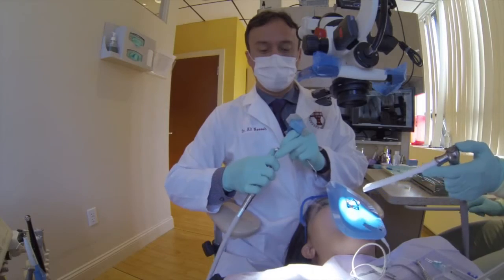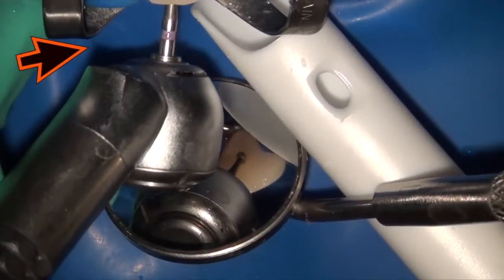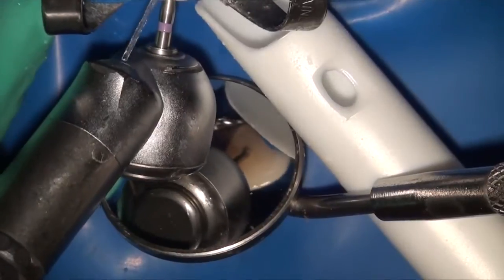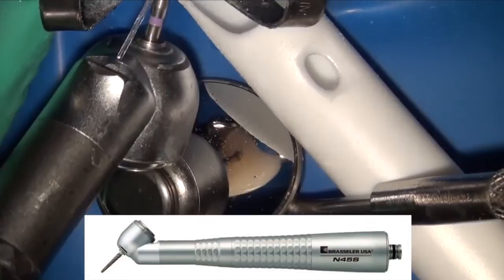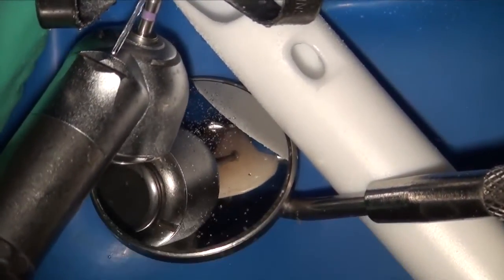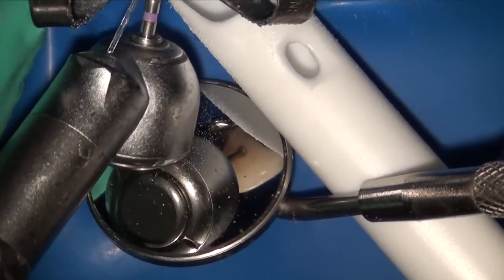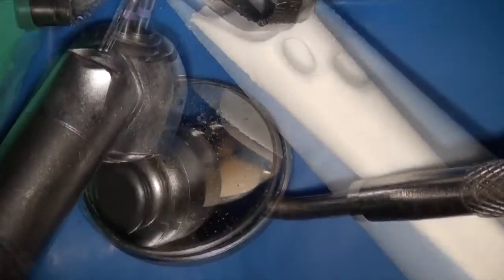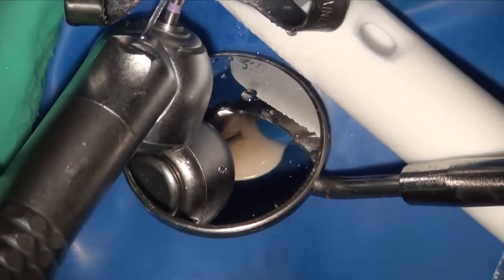So I switch from the regular handpiece to their surgical 45-degree handpiece. What this allows me to do is to change my orientation so I can come in, no longer interfere with the clamp, and at the same time have a more direct straight-line axis. This is the surgical handpiece that you would use during extractions as well as apicoectomy procedures. You can also use it during non-surgical root canal therapy, and in this case it allows me to have better access.